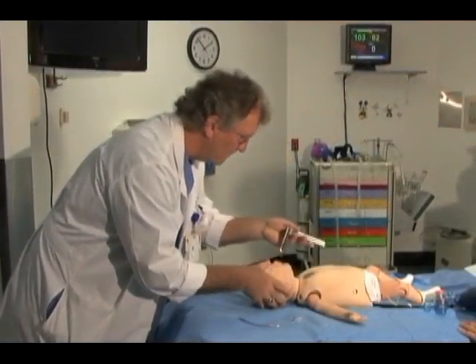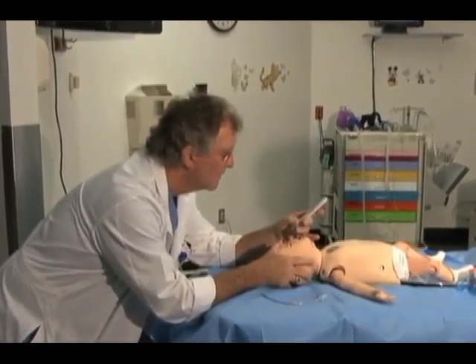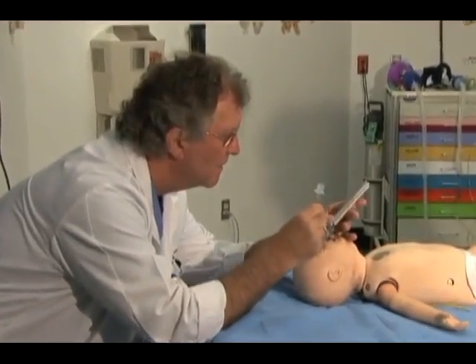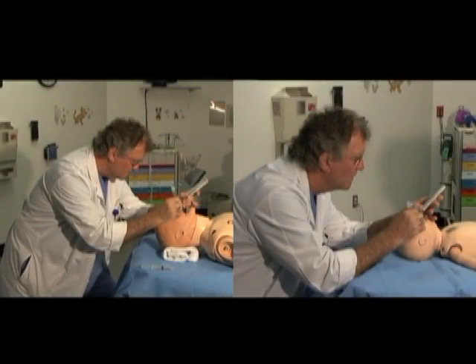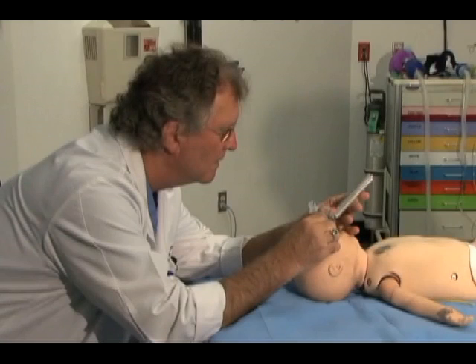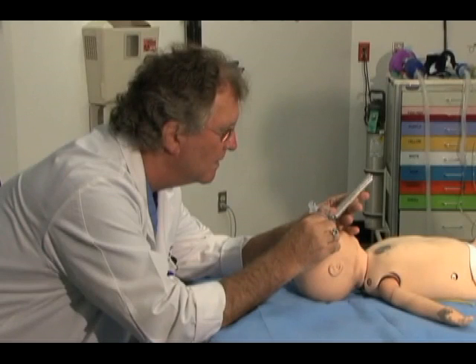The pediatric airway lies higher in the neck than the adult airway. When doing direct laryngoscopy, the visual line of sight angle must be adjusted so that the intubator can look up to see the glottic opening. Note in this sequence the angle of sight of the intubator — note how the angle of sight is more horizontal when intubating a child. Physicians who rarely see kids and do not make this adjustment may have trouble visualizing the glottic opening in children.